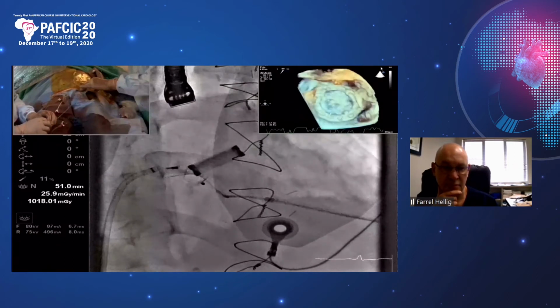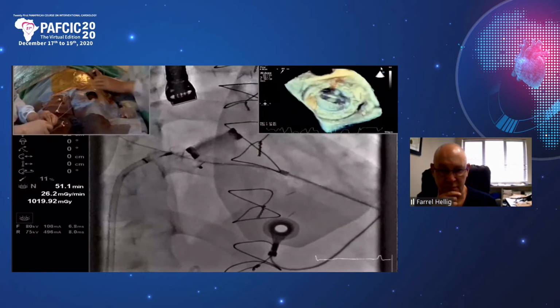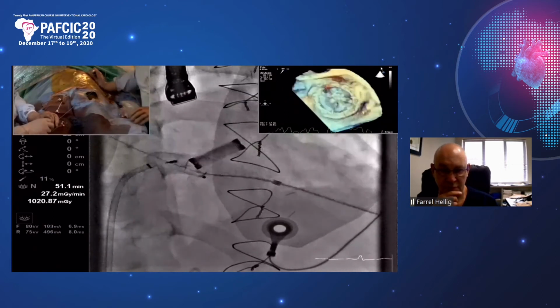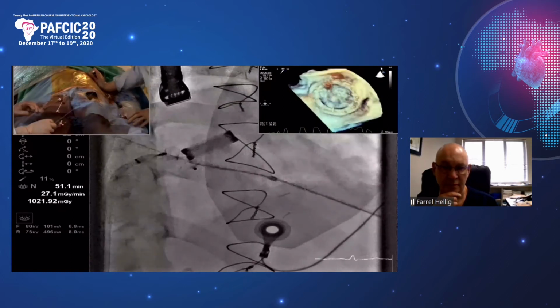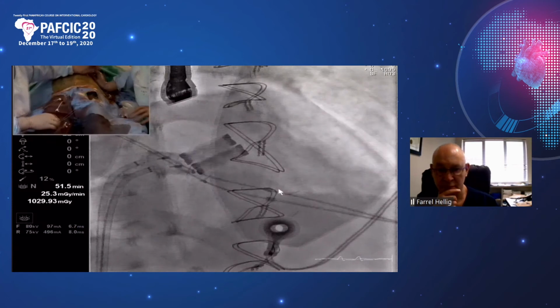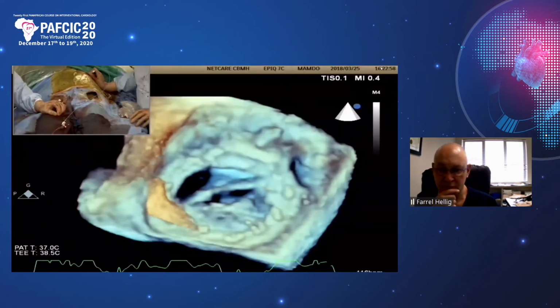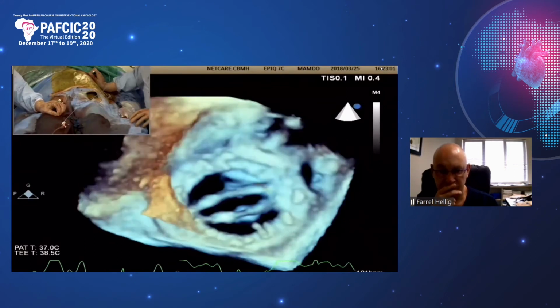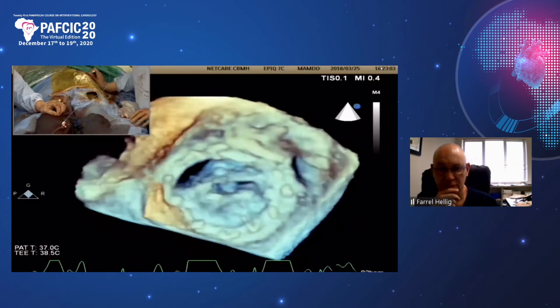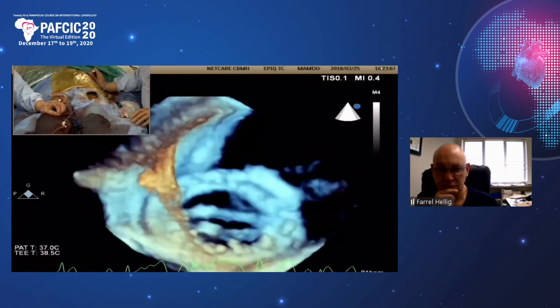It's trying to cross. Okay, we're across again, in the right place. Yeah. Just get the wire deeper. Okay, we're across with the sheath. There you go. The sheath's across now. Then we'll leave this cable attached, and then we'll release them simultaneously afterwards. I'll go parallel to this cable.